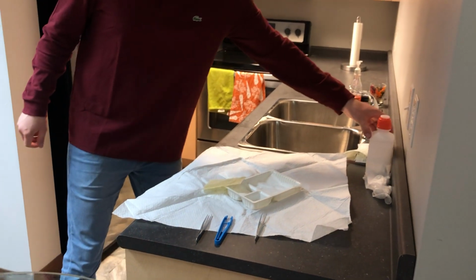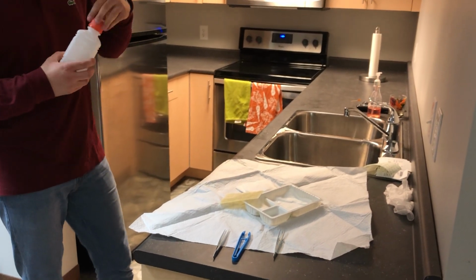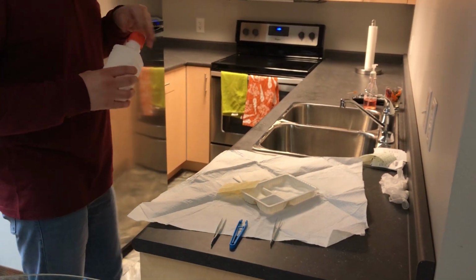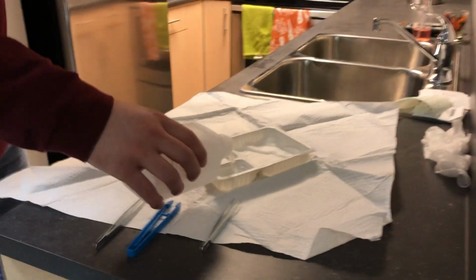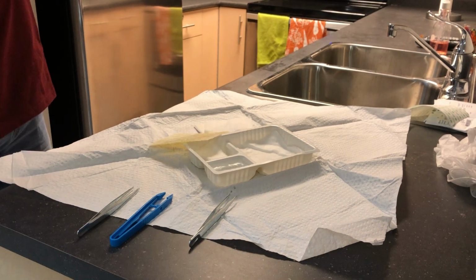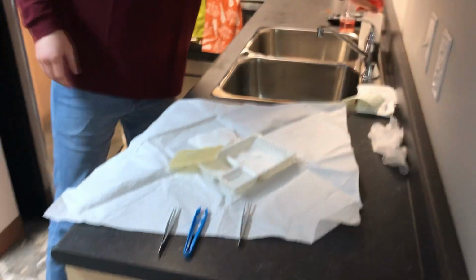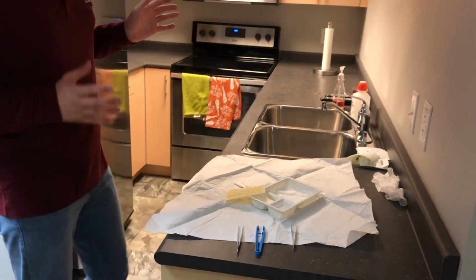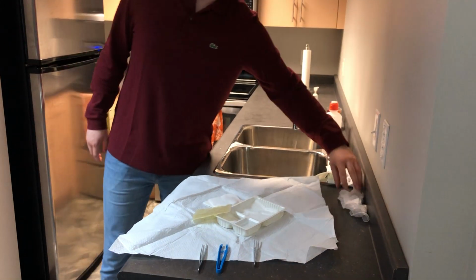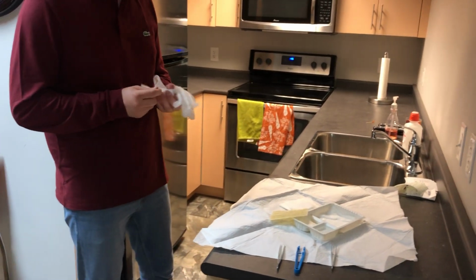Okay, and then finally, add some normal saline. The bottle's not expired, it's intact. It's a fresh bottle, so I can use it here, add it to my tray. Good. That off to the side. Okay, now at this point, I've set up my sterile field with all the items that I need. So now I can start to remove the dressing.